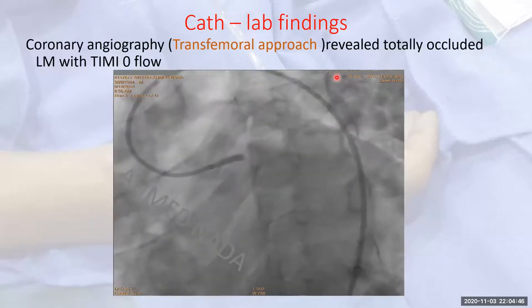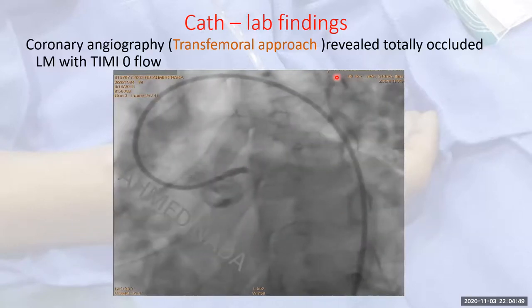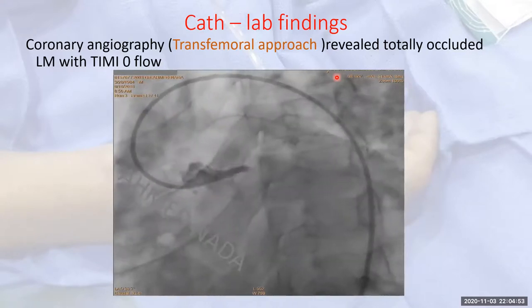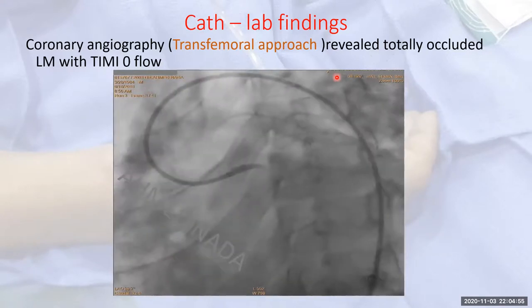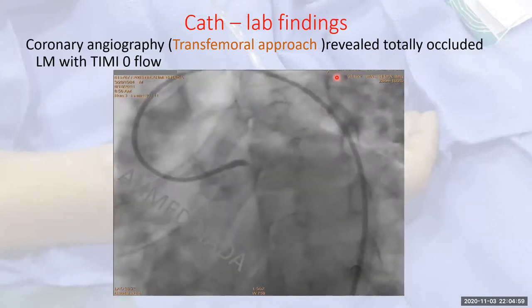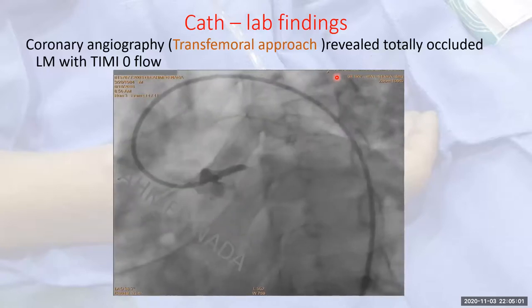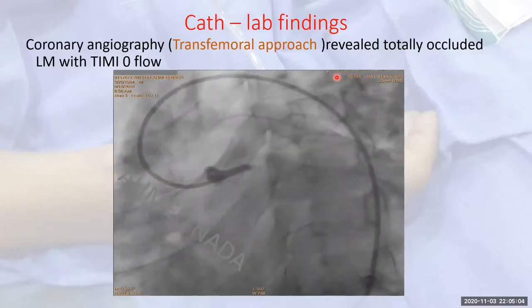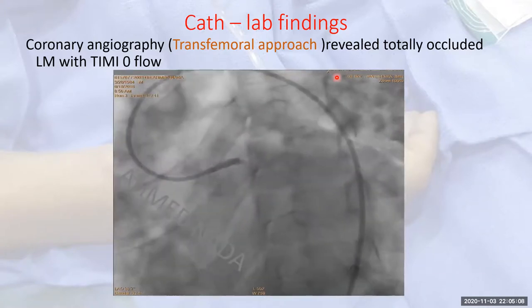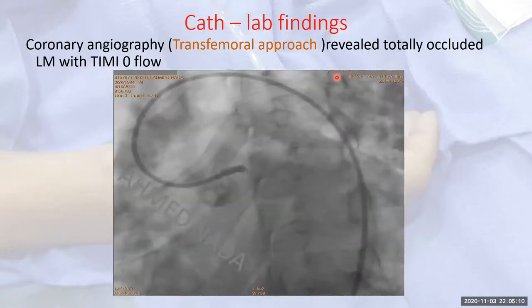In that patient, post-arrest, hypotensive, in a critical situation, we didn't have the leisure of time to wait and try to puncture again. We tried to raise the inotropic support. We tried to give boluses of fluids just to increase the blood volume, and tried to puncture the radial, but we failed. So at that time, it was okay, this was the time for femoral, and we thought that he might need an intra-aortic balloon or whatever, so it was okay to go with that approach.